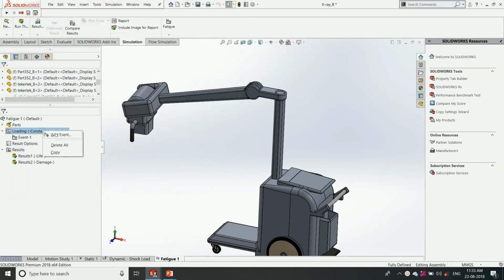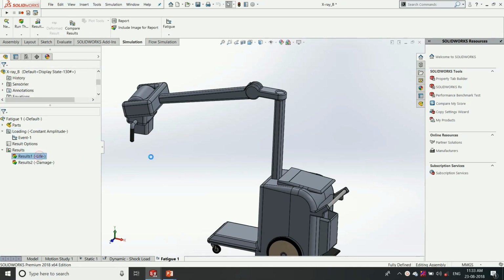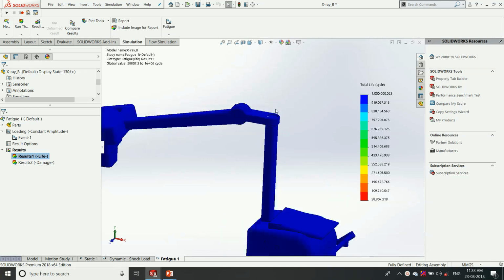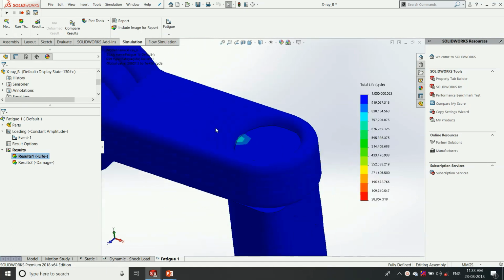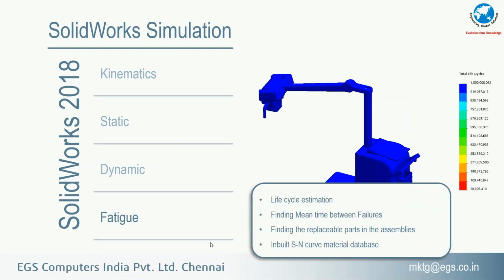Now adding events. Adding an event is nothing but including whatever study we performed here, and we choose the number of cycles we require. Now in the results, we can see the life of the structure and the damage percentage. In the life or damage percentage plot, we can see the particular region of failure. Here we can see this region has less life, which means the failure may first occur at this region. By predicting this, we can have an alternative solution for that particular region. So in fatigue, we calculate the life cycle and find the mean time between failures.